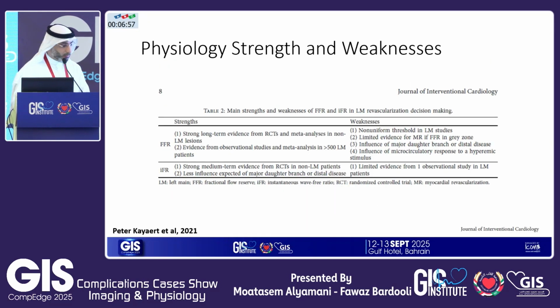So what are the strengths and weaknesses of FFR? We talked about some of them already. You have disease in the daughter vessels and how that affects it. You don't have strong, robust evidence for left main lesions. I'm a CTO person, so I'm going to integrate CTOs into all of my talks. If you have a CTO of the RCA and you have a borderline left main lesion, that can be falsely positive because you're also supplying the RCA territory. There's good evidence that if you treat the CTO in these situations, the IFR that was originally positive will become negative.